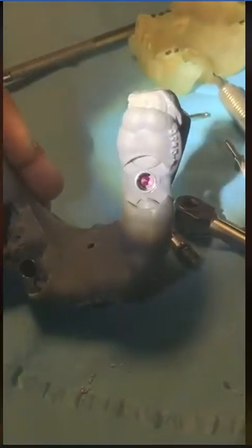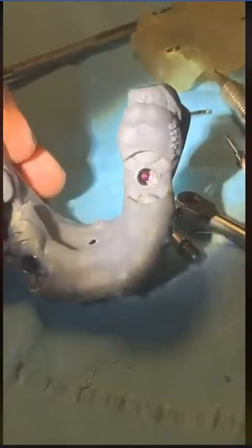now this implant company, there are notches in here. I don't know if you can see it actually. This implant company recommends that you place their implant a millimeter below the osseous. So I'm seated all the way. I remove and take a look. We are exactly where we want it to be. Okay, we're exactly where the implant is supposed to be, in a perfect location.